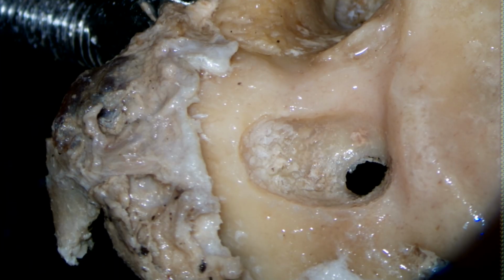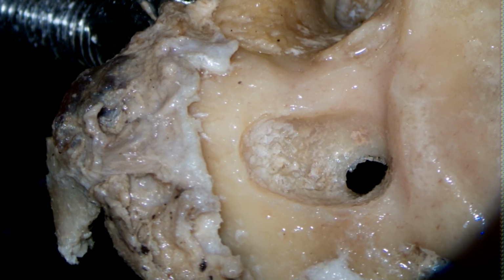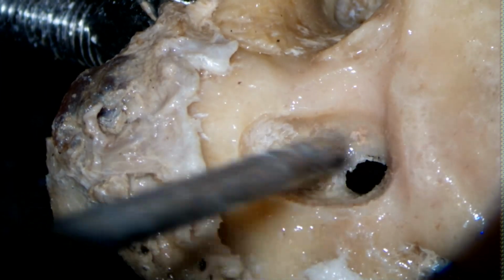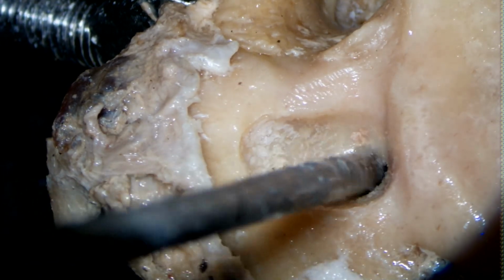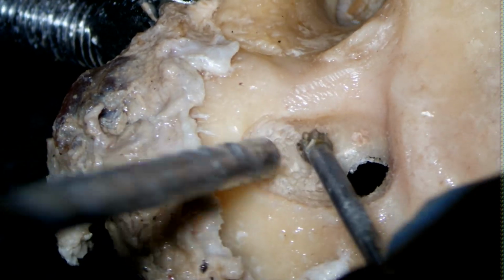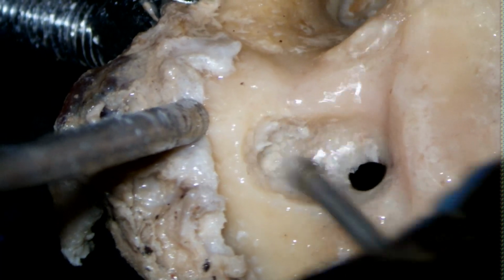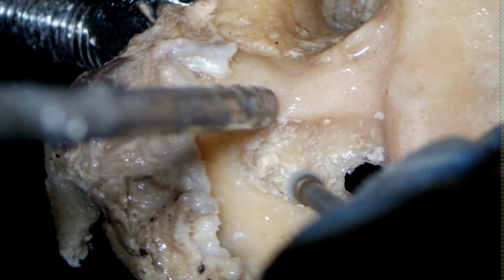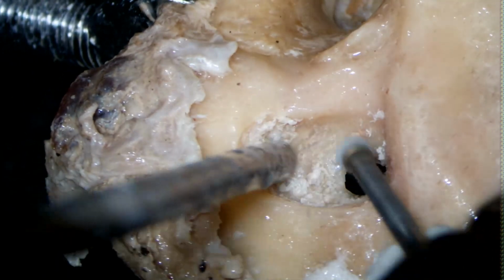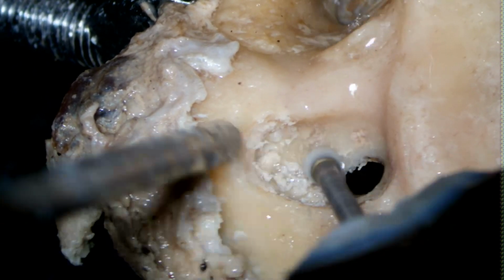So again this is a very contracted antrum and we are not finding any mastoid air cells. So go slowly and try to find. So this is the side of the dural plate and we will go anteriorly.